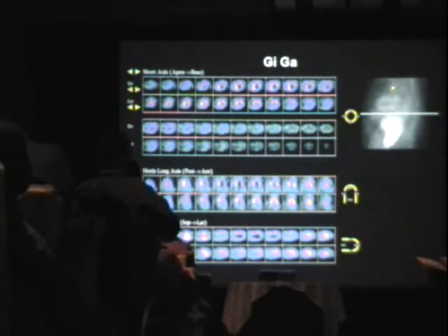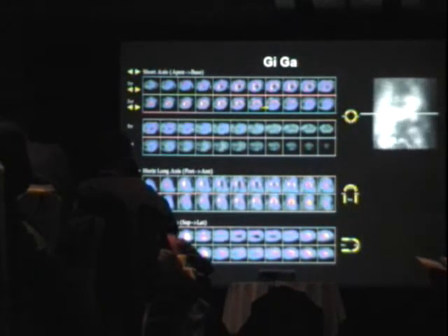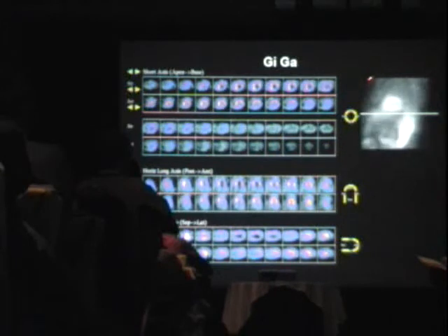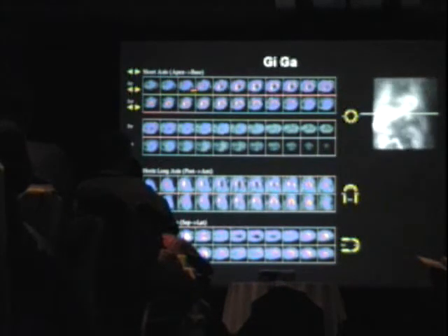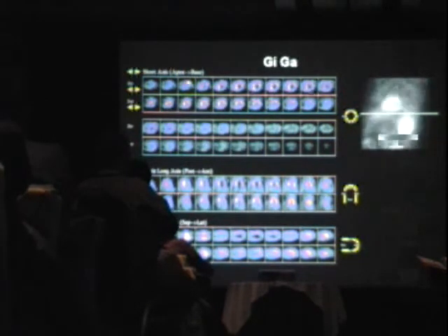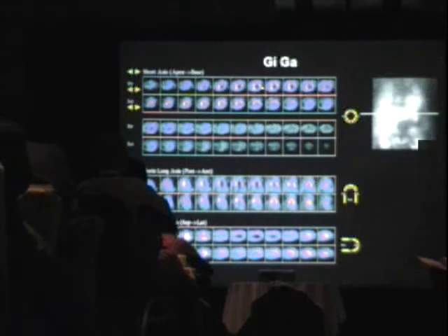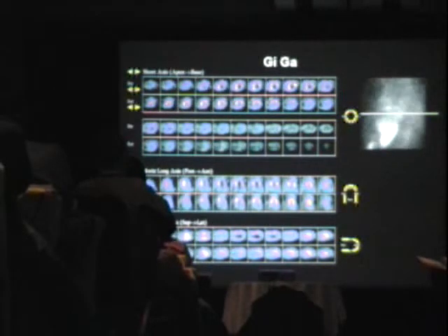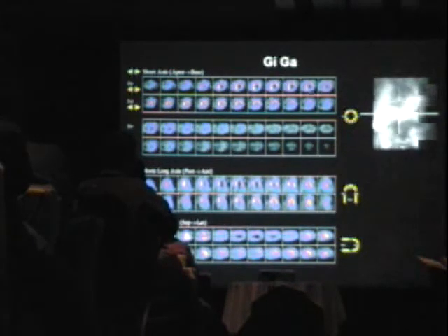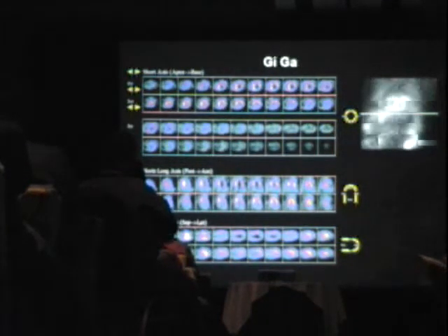You look at that, there's significant lung uptake here. So this is a sign of a high-risk scan. Then you look at the image, and the cavity looks larger on the stress compared to the rest. So the TID, there is lung uptake, and there are multiple perfusion defects involving the LAD. Here you have anterior, anterolateral, showing reversibility. So there's ischemia in the LAD, but there's also ischemia in the other territory here, obtuse marginal circumflex distribution. And so this is a patient with high risk features. There is lung uptake, there's TID, and there are multiple perfusion defects.